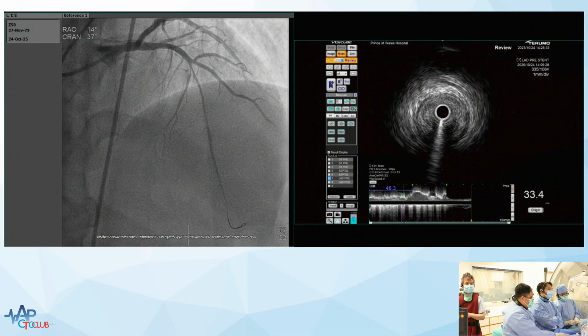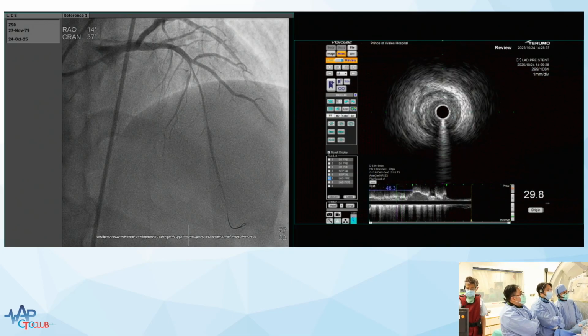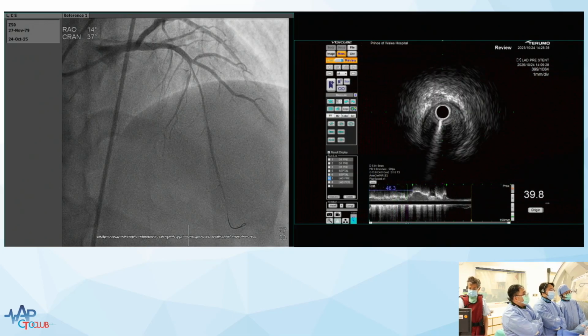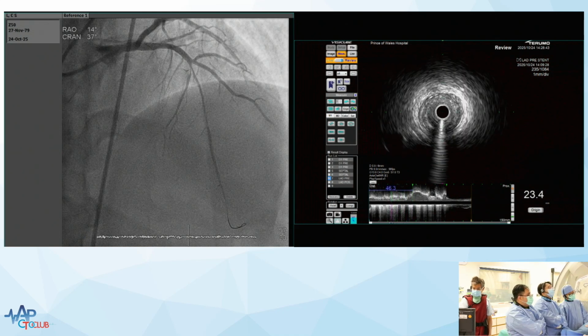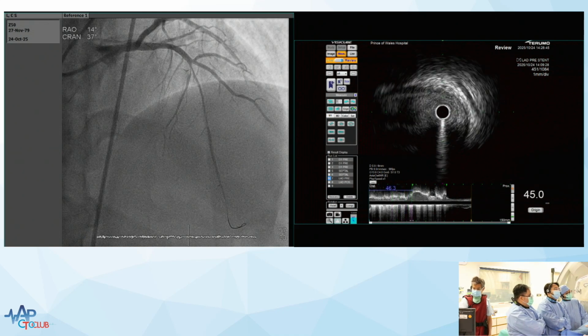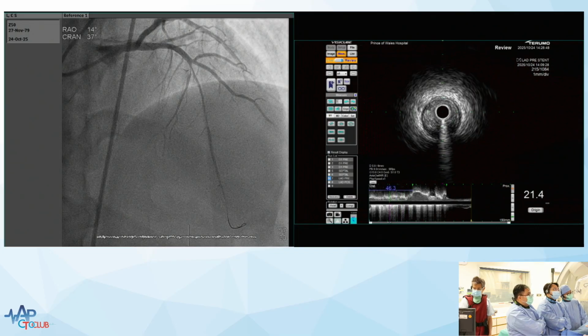So you DCB without any stenting? No. I'd probably cut it and DCB it, and there's lots of operators in the room probably now that do a lot more DCB than me, and I don't think there's any downside to it if you prepare it properly. Okay, well, we might take a poll of the room. So you've got three options, right?